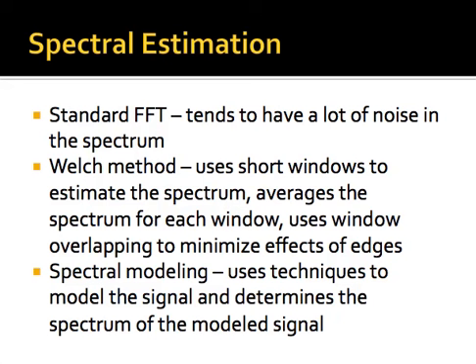And so you would ask, well, why in the world would you want to do that? Because aren't real data always more accurate than model data? And the answer is yes, if the real data did not have these limitations that we've discussed in the past. So sometimes a person gets a smoother spectrum that's more characteristic of the signal if spectral modeling is used.